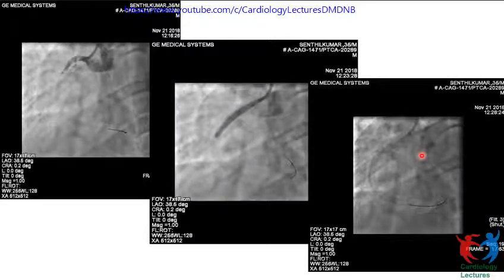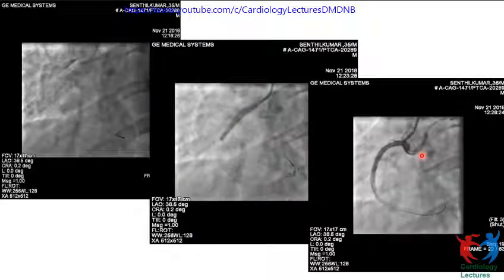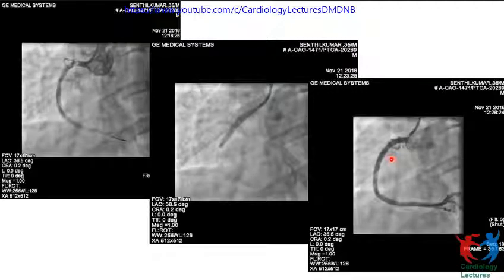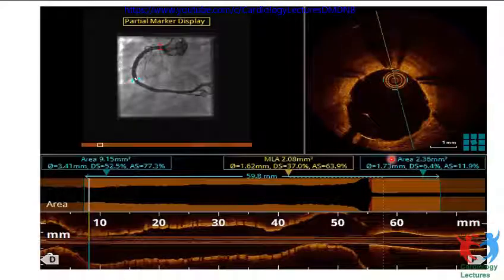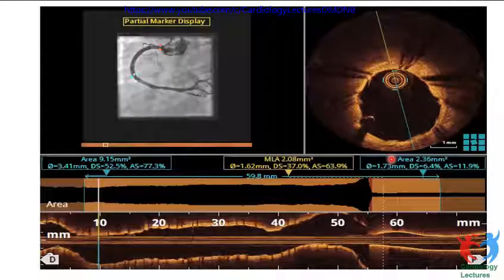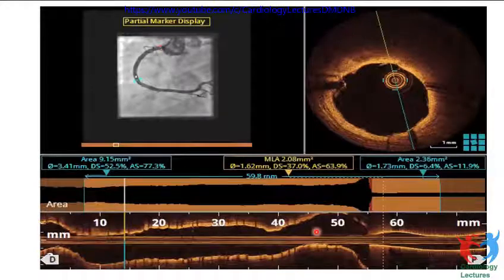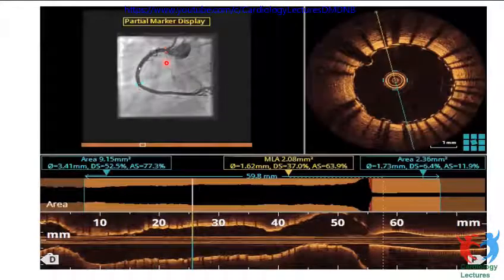This type of stent dissection, when the wire is there and you recognize the dissection very fast and then you do it with image guidance, then there's no problem. Technically it is not a big issue. It is a straightforward procedure. And of course, post-stenting, the role of imaging here is, one important thing, you get the exact sizing of the stent, which is very difficult to define just with angiogram when there is a dissection.